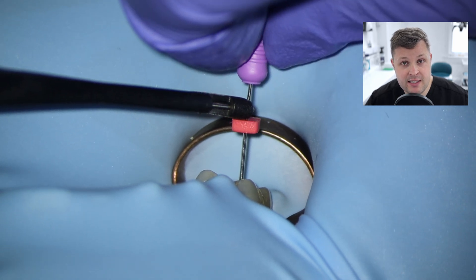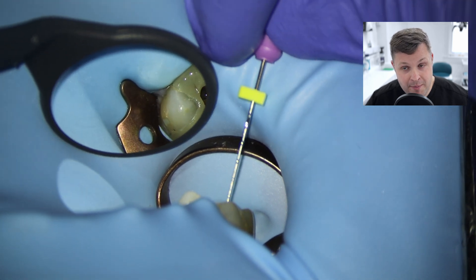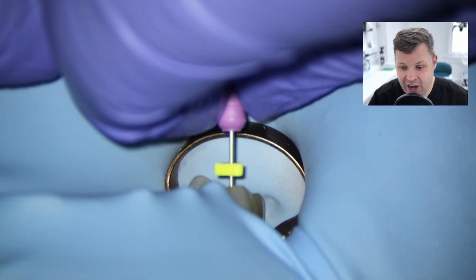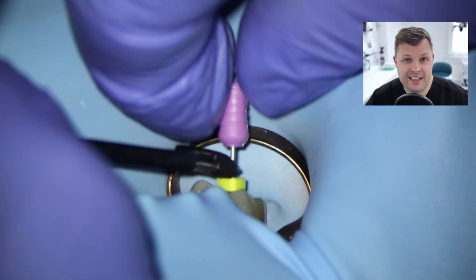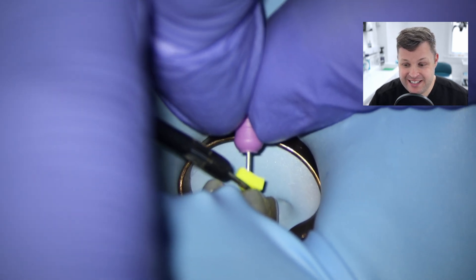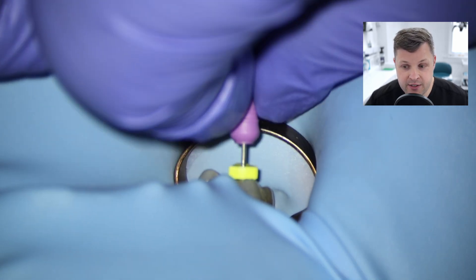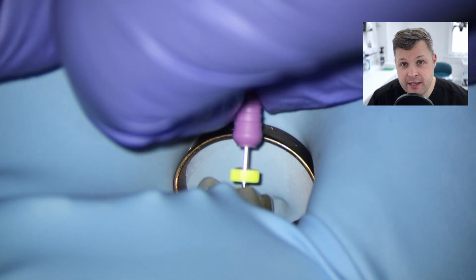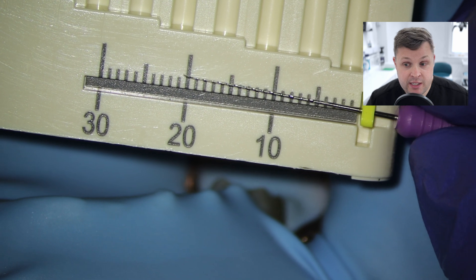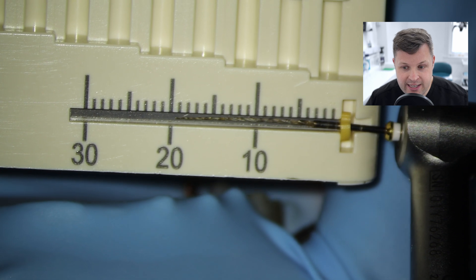If it's not going to go with a size 10K file, or an 8 or a 6, it's not going to go with a rotary file. One thing in my armamentarium which I really like to use is D-finders. The great thing about D-finders is: when you can't quite get to length on your size 10K file, you get these D-finders out and for some reason it just reaches zero. I think it's because they've got a smooth bore, so they can easily slip into very calcified or sclerosed canals. We can now find the MB zero reading is 21 millimeters, and we're ready to shape straight away.